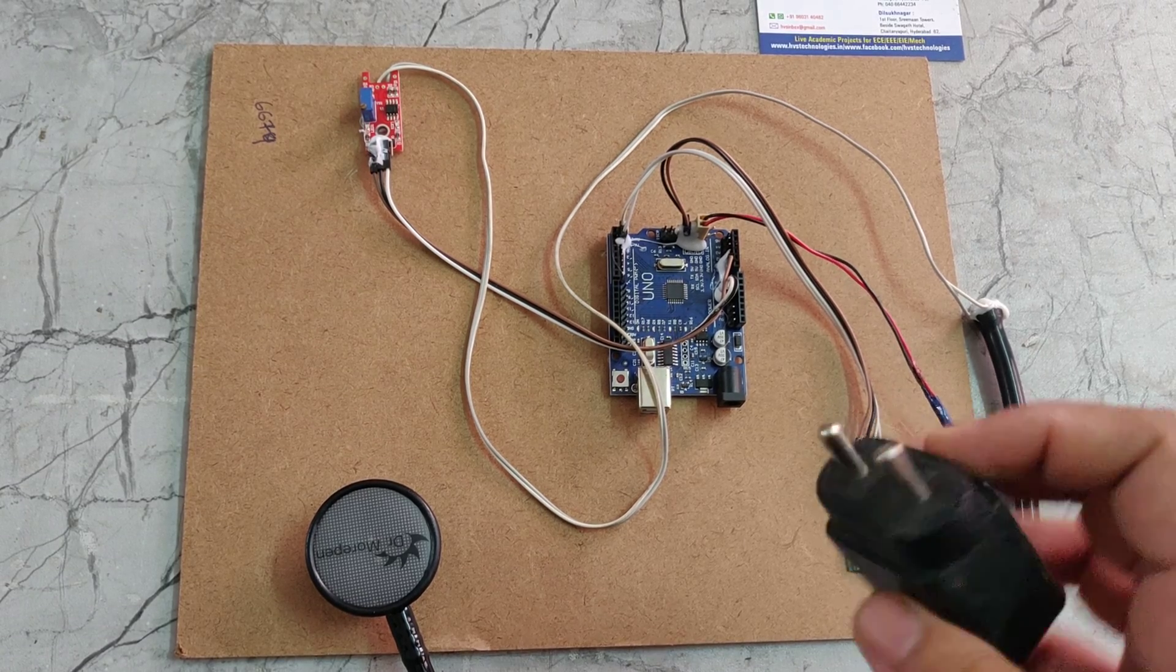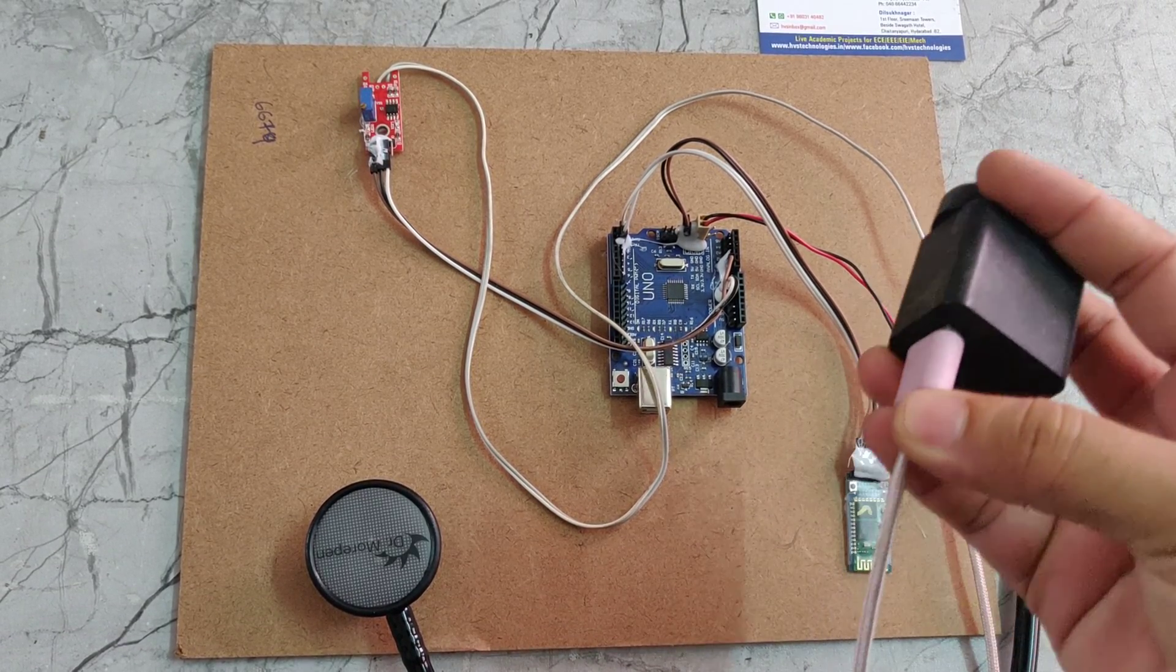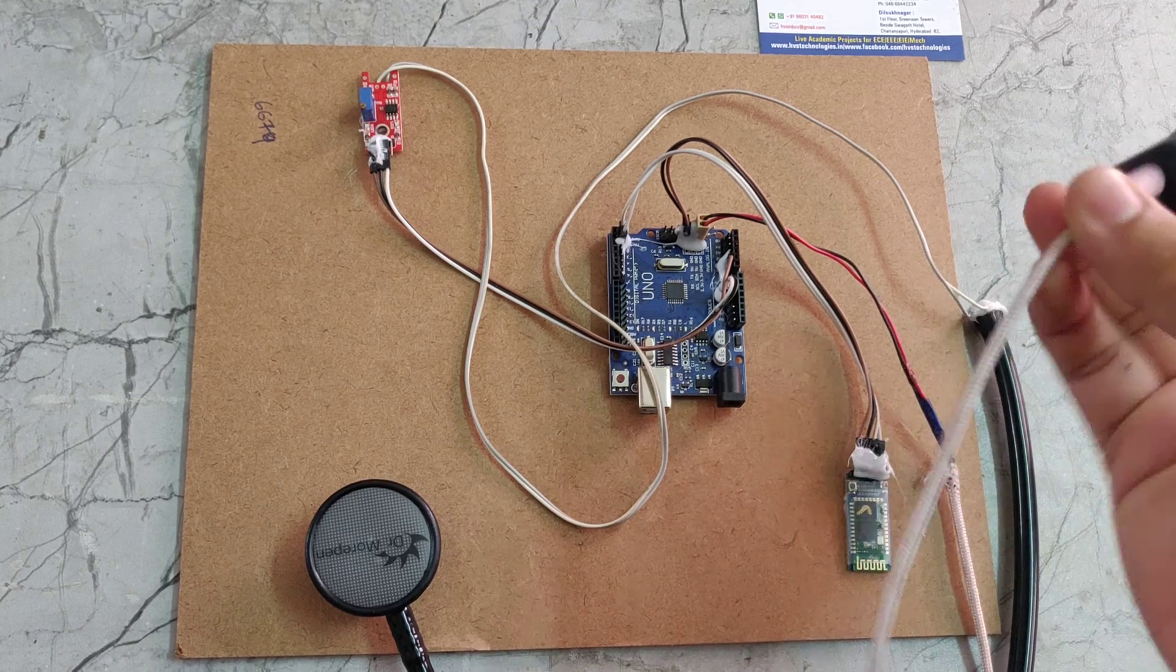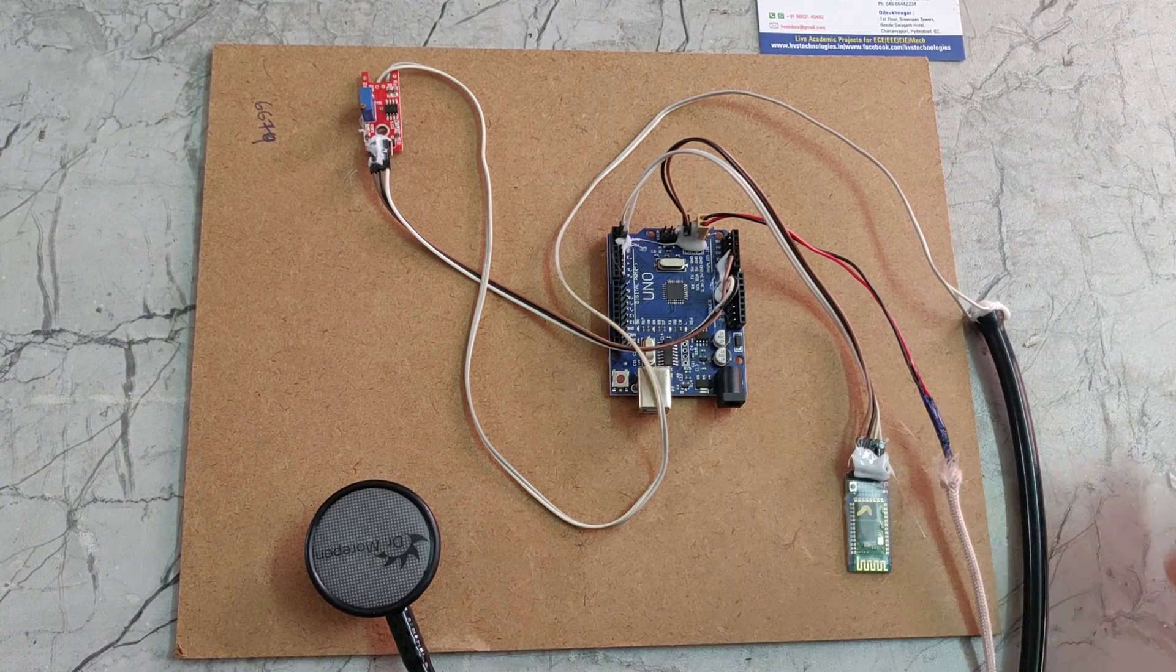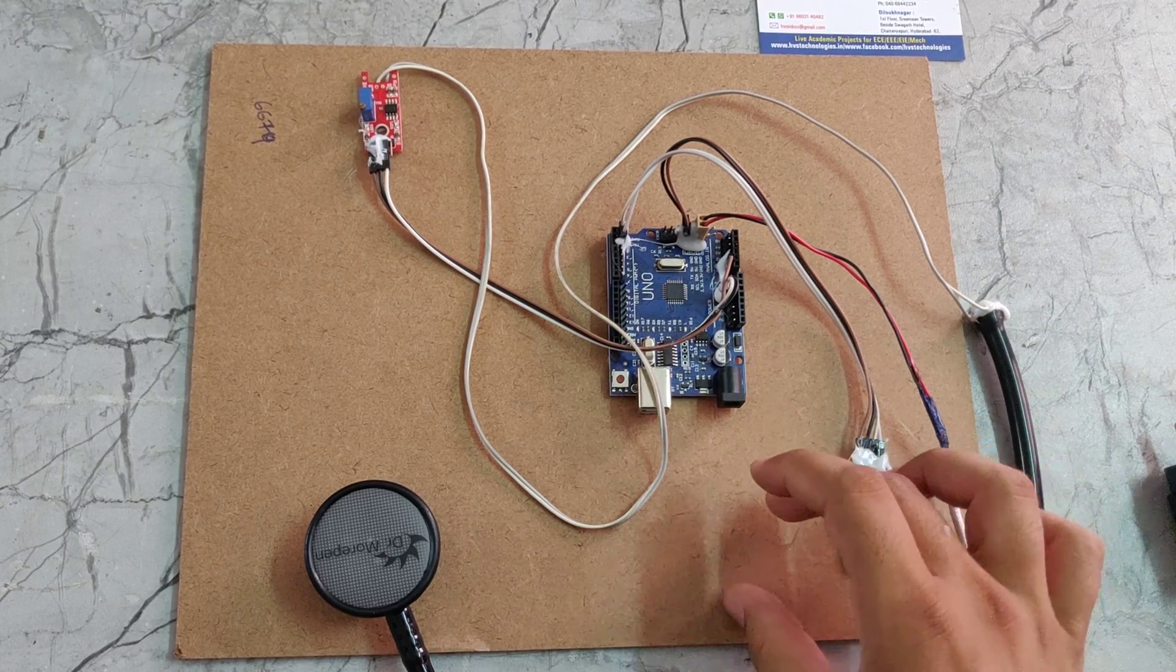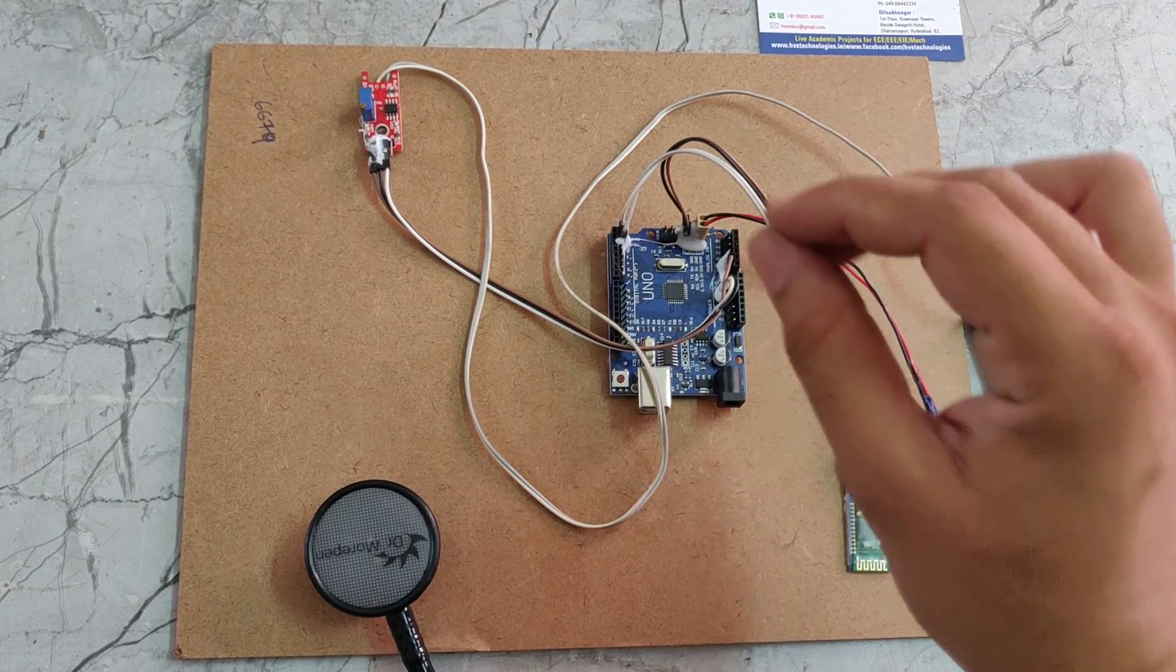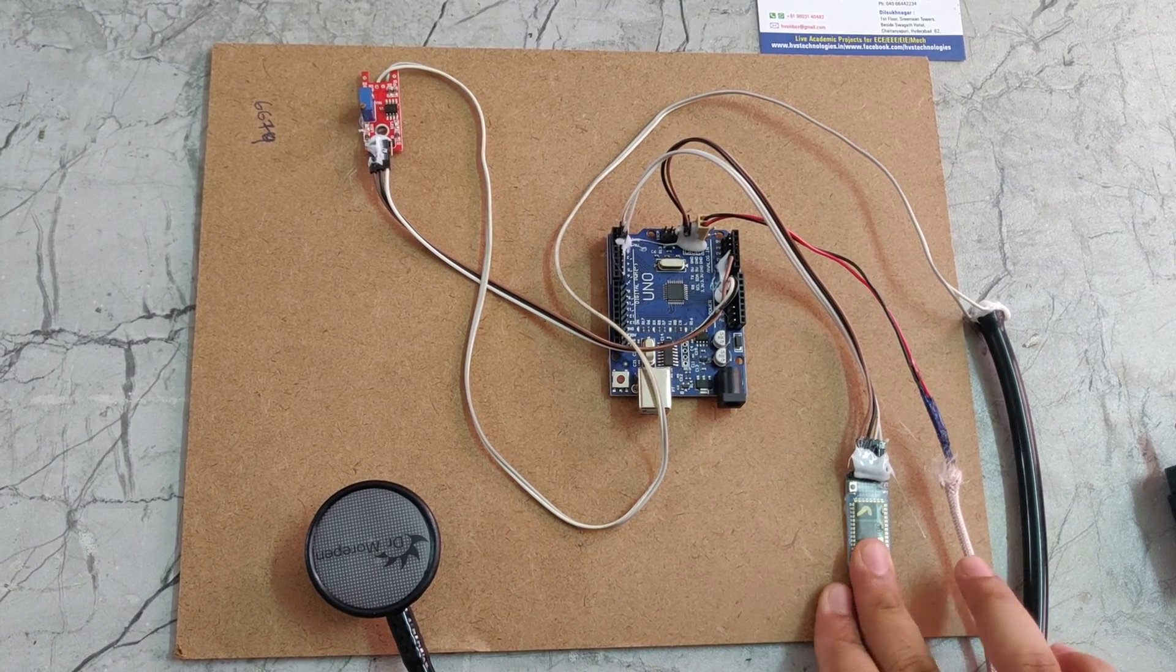We are providing power supply through this adapter. It takes 230 volts of power supply. The output is 5 volts DC. That 5 volts DC will be given to this Arduino Uno. Through Arduino Uno, we are giving the 5 volts power supply to the sound sensor and Bluetooth module.